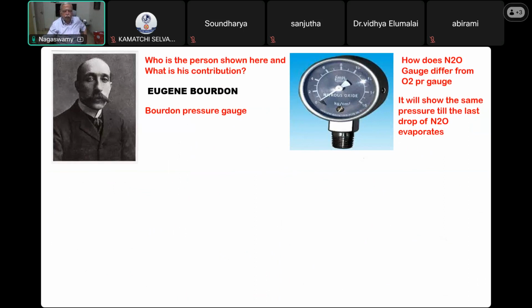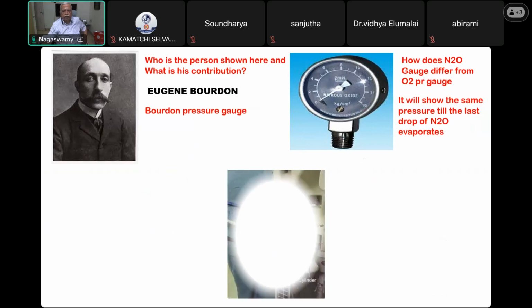So in order to make sure that you can replace or open a new cylinder within the time that the cylinder becomes totally empty, they incorporated it. Okay, and not for the normal regular general surgical cases. It is incorporated mainly for the cardiac and neurosurgical procedures. But nowadays, even this may become obsolete, because nowadays we are slowly weaning off from using nitrous oxide and we are going into a combination of oxygen and air.